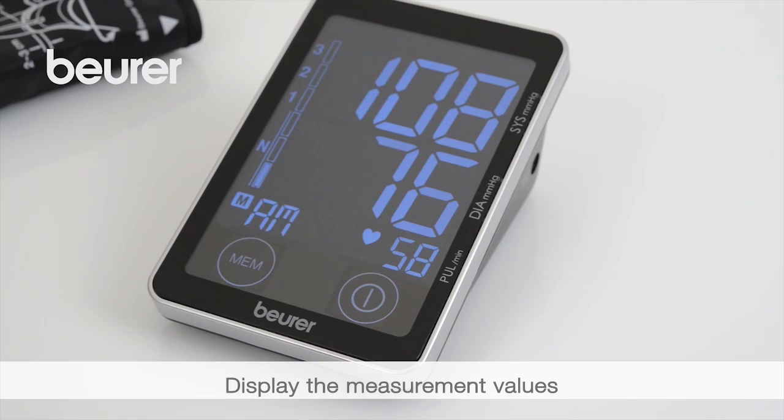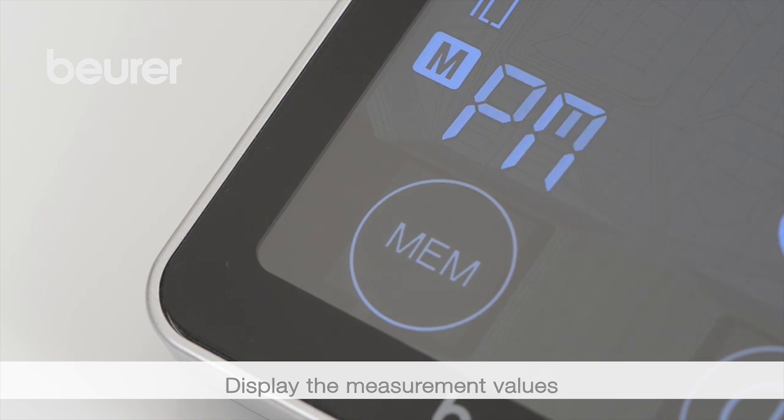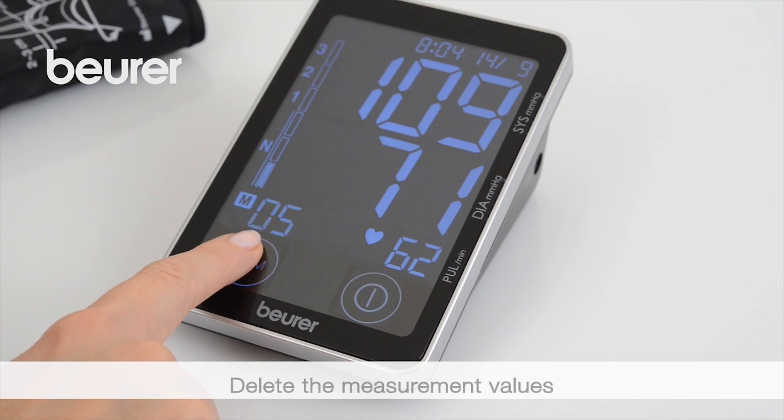By repeatedly pressing the MEM button, average values for morning and evening can be called up, as well as other individual values. To delete the values, press and hold the MEM button for three seconds.